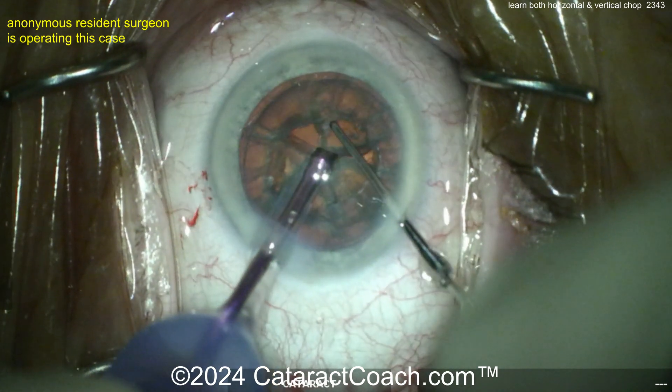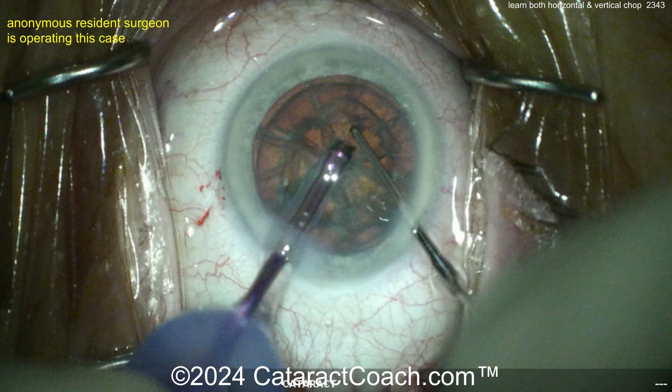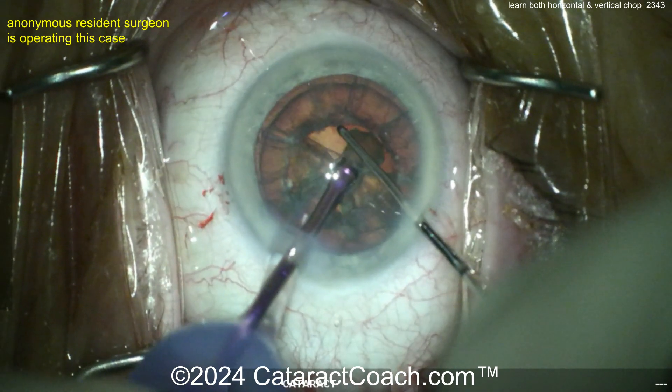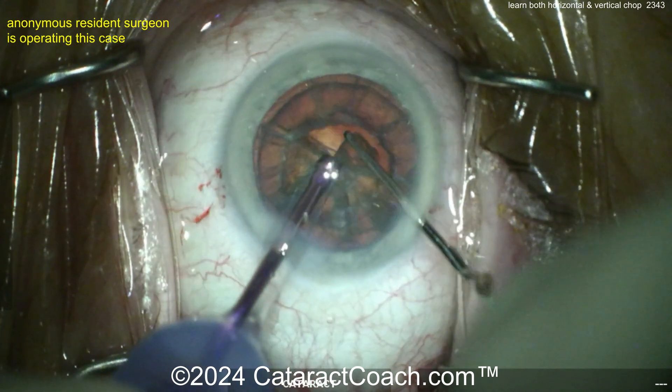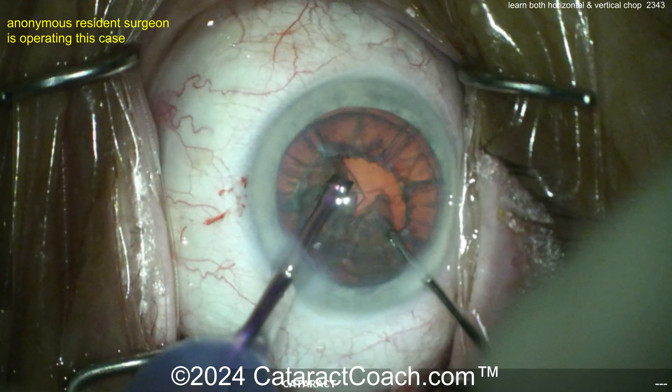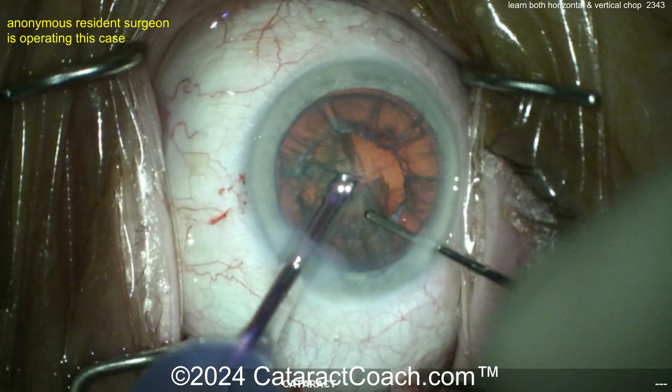Again, rotating these pieces around — now that you've chopped them up, it's easy enough to remove them, and you can even use the same setting. The nice part with doing this horizontal or vertical chop is the settings I use for chop are essentially the same — in fact for me it is the same setting — as for pieces removal, nucleus removal, quadrant removal.